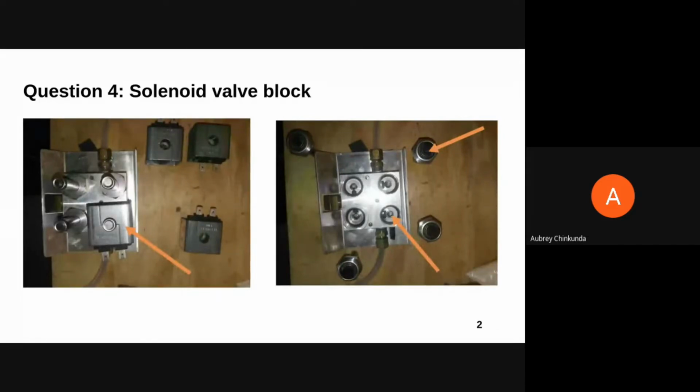As time goes with the continued pressurization and depressurization of the sieve beds, the zeolite keeps rubbing against each other in the process, especially if the zeolite wasn't nicely compacted. And this leads to the formation of dust within the sieve beds. Some of these dust particles make their way out of the sieve beds. Since they have to go through the valve block, the particles begin to accumulate in the valve block, and this causes a blockage in the system.